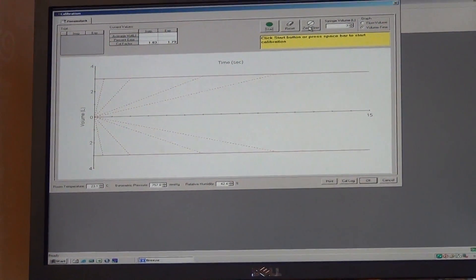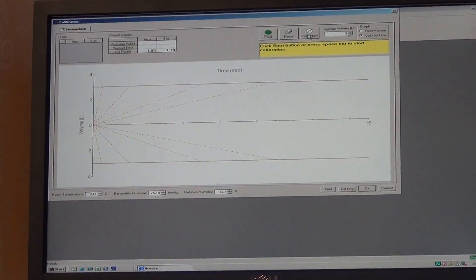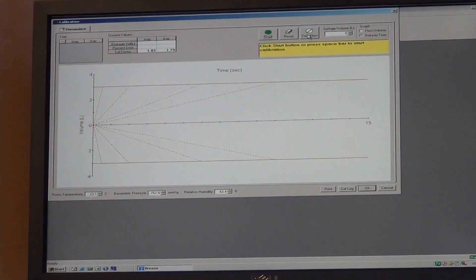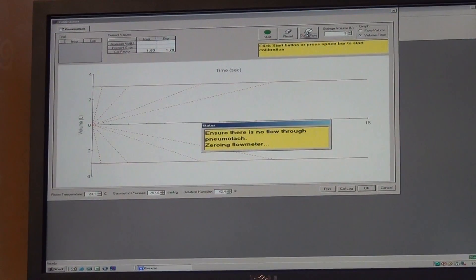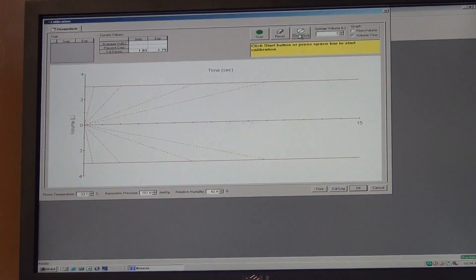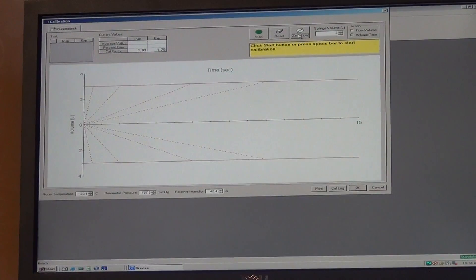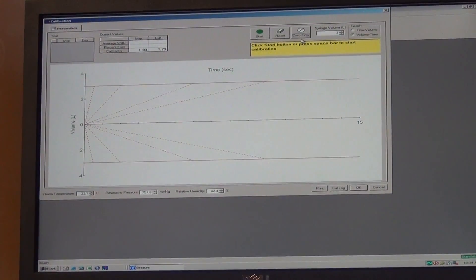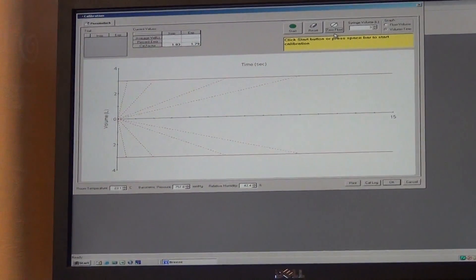Then before we start, you have to make sure there's no flow going through the syringe, so you press the zero flow button. Also be careful during the zero flow not to move the syringe at all.